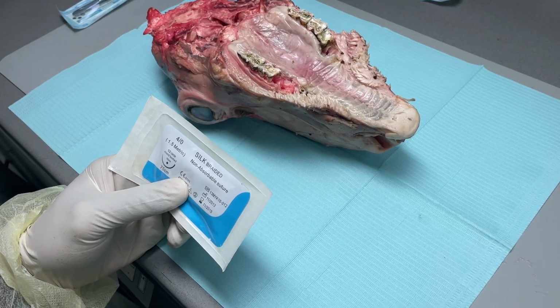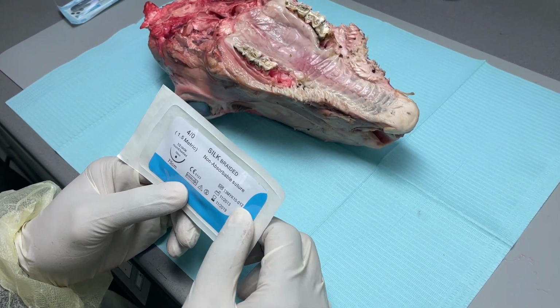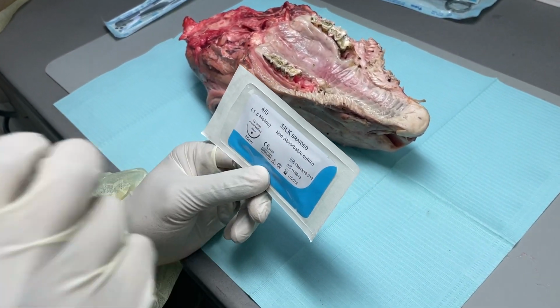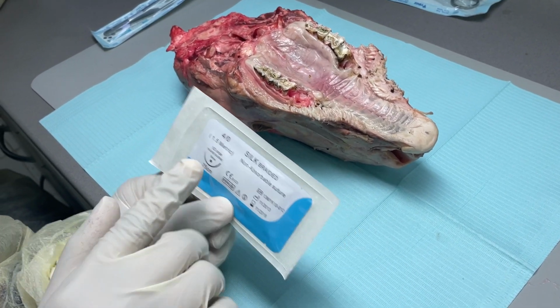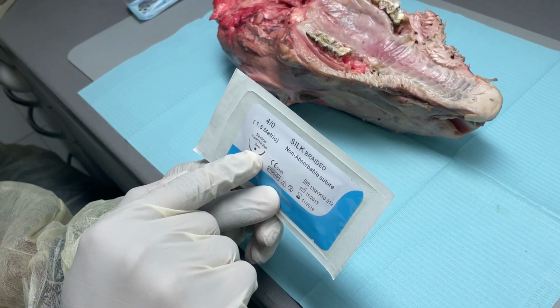Non-absorbable means you have to remove it later, right? Removal after 7 days. Okay. This is the total length of the suture material, 75 centimeters. That's the suture. 16 millimeter is the needle.